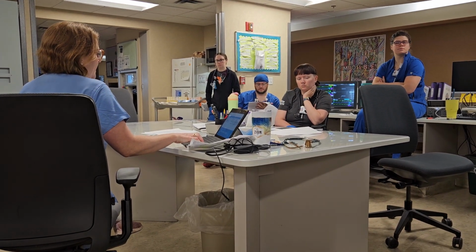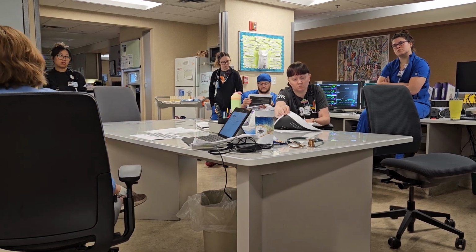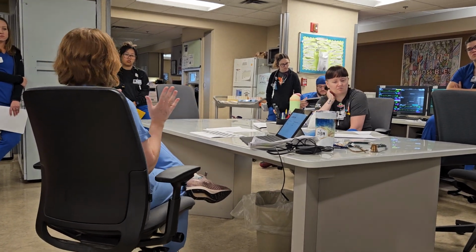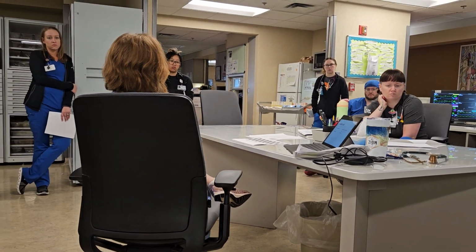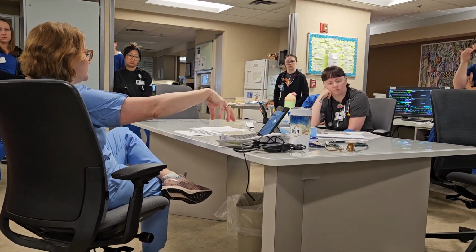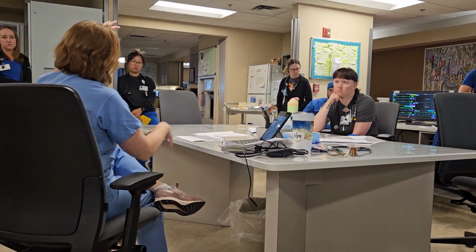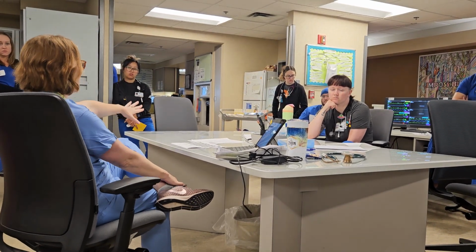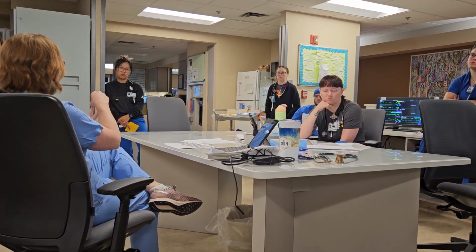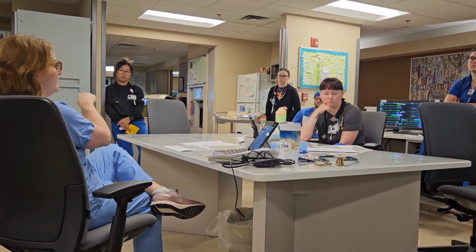And then finally, the very last slide, my to be continued slide for the next go around, where we can talk more about the specific types of acute respiratory failure and hypercapnic respiratory failure. One thing I wanted to mention is on the ventilator, if you have somebody who's got hypoxic respiratory failure, they have an oxygenation issue, there's two things that we can really adjust to affect their oxygenation. They are the concentration of the FiO2 and PEEP. Those are the two things that affect oxygenation.